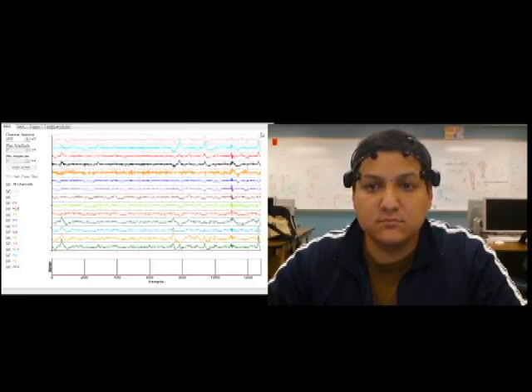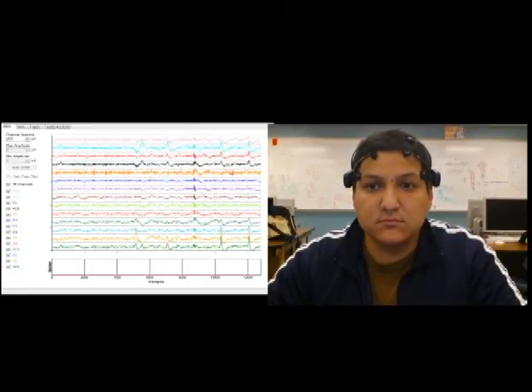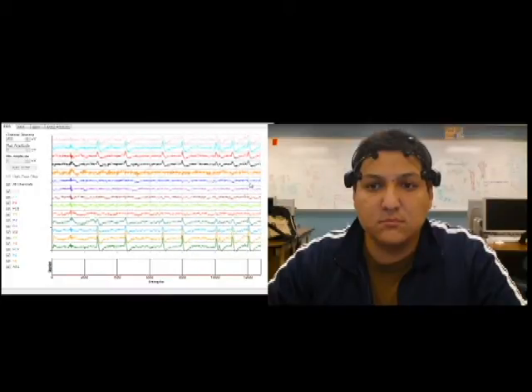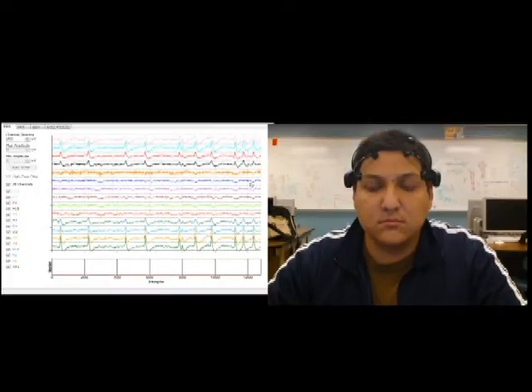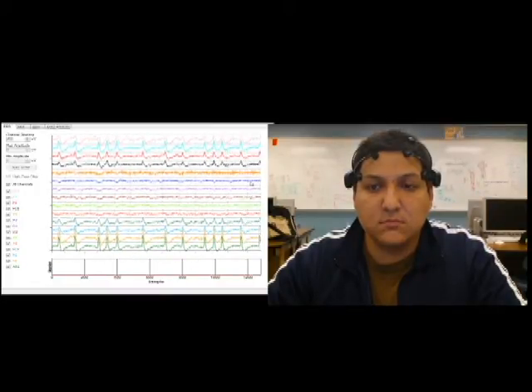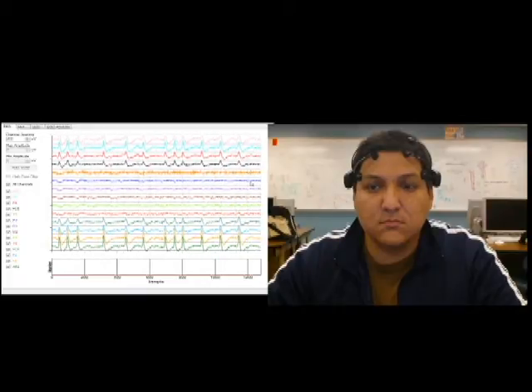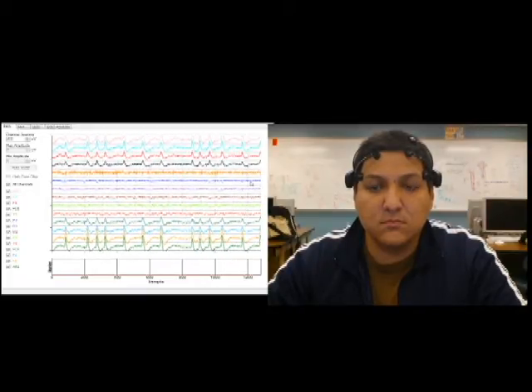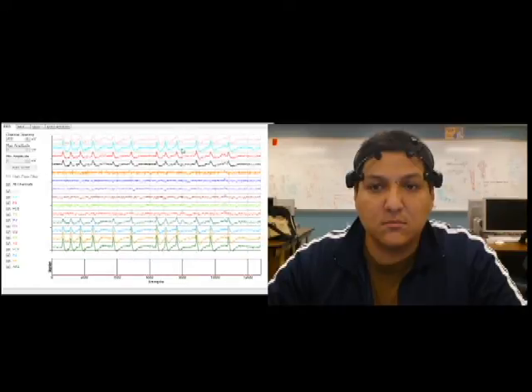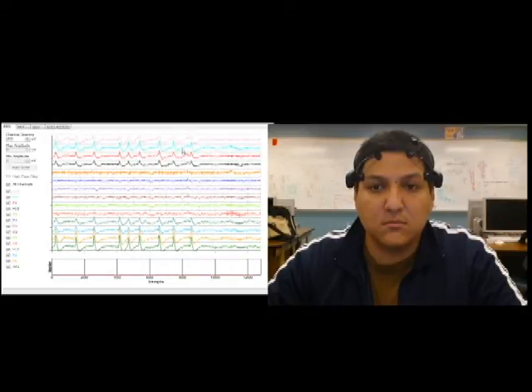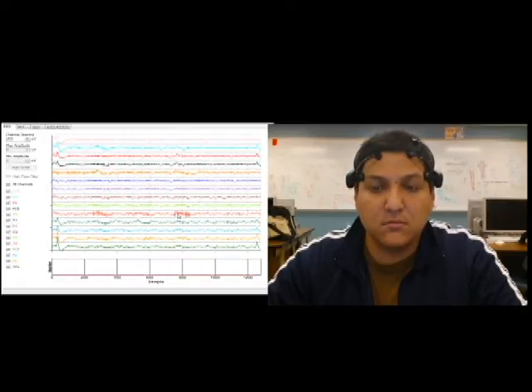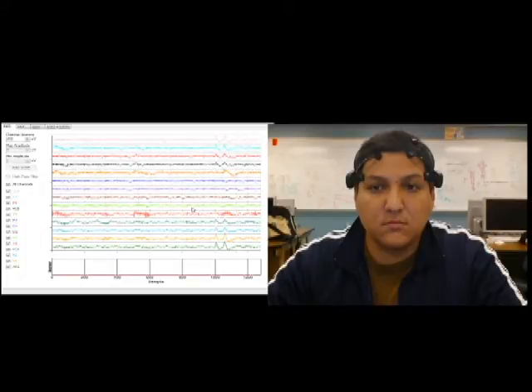The subject is demonstrating the EEG output using Emotiv's test bench software. Each graph represents voltage potentials that occur at different locations on the scalp. Each blink is represented by a voltage inflection, which can be seen on the graphs each time he blinks.